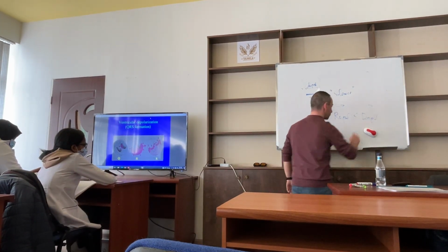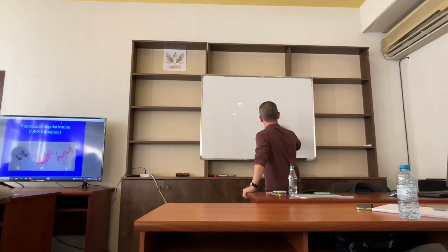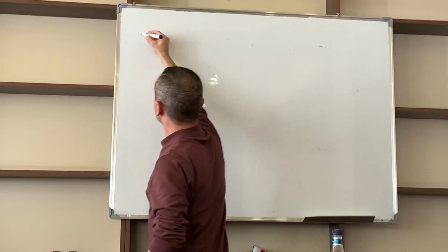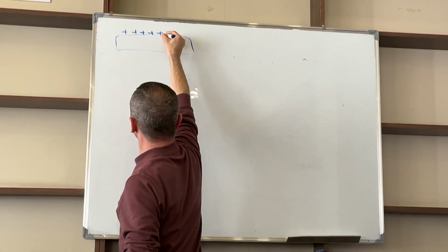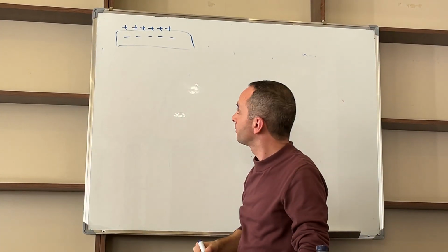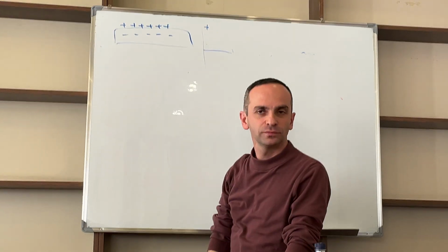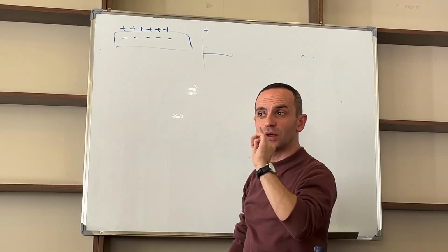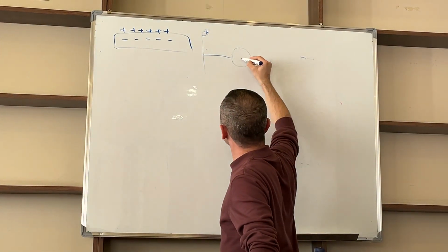Okay, look how it happens. We are taking one myofibril and here is placed one positive electrode. Doesn't matter what, because it's V1 or V5, that doesn't matter. It is one myofibril. And here is attached device which is measuring difference of potentials.